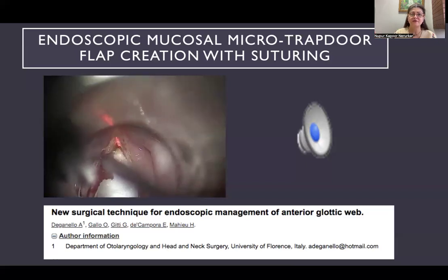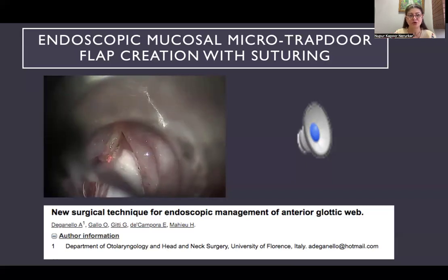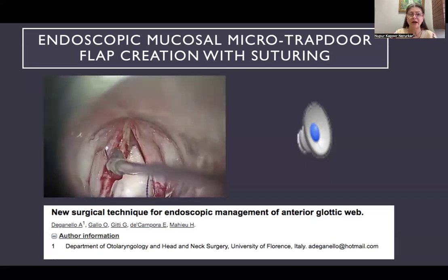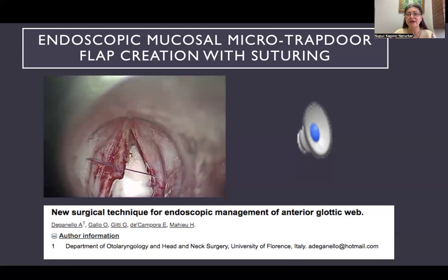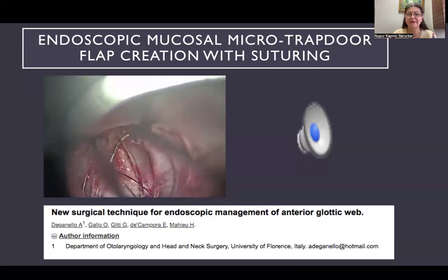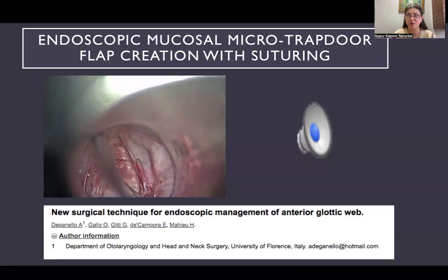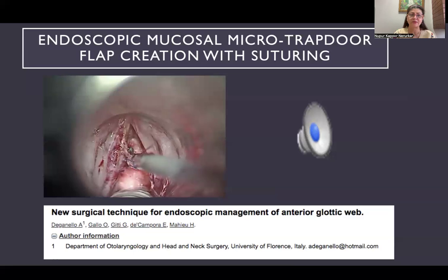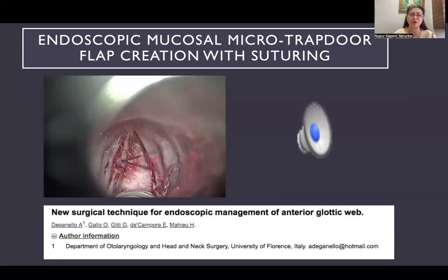The undersurface of this flap is then freshened, and the flap is then sutured to the left vocal fold from superior to inferior. So these are vicryl sutures being taken with the 6-0 vicryl to suture the epithelium onto the undersurface or the infraglottic surface of the left vocal fold. The idea is at the end of the surgery, one has one vocal fold which has got an epithelial cover. The knot is taken outside and it is slid down with a knot slider.